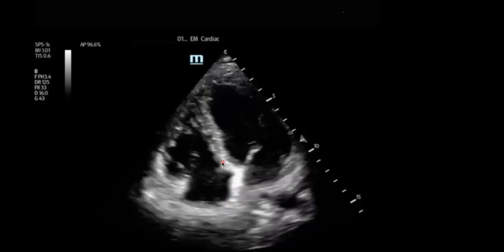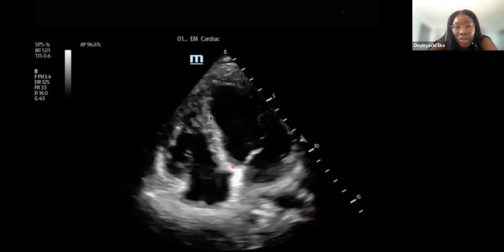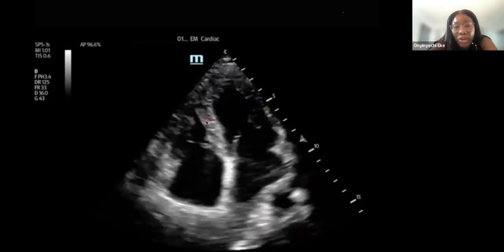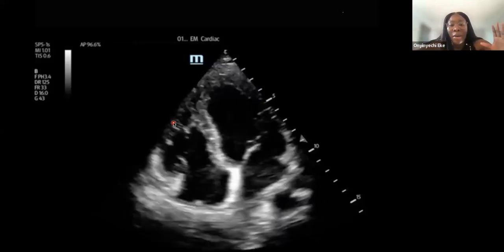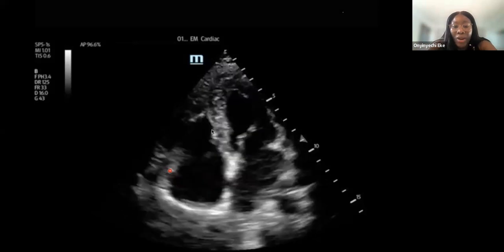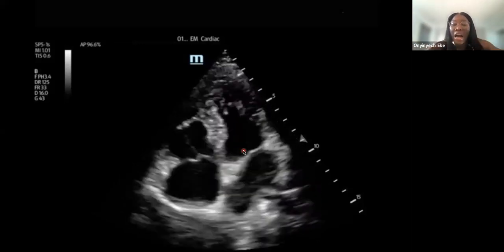No problem. So the tricuspid valve is more apically displaced compared to the mitral valve. The right ventricle has the moderator band that goes across. That is only on the right side of the heart. The moderator band is just a trabeculation that crosses across the right ventricle. And then the squeeze of the right side is more up and down, or longitudinal, and the squeeze of the left side is more inward and outward.